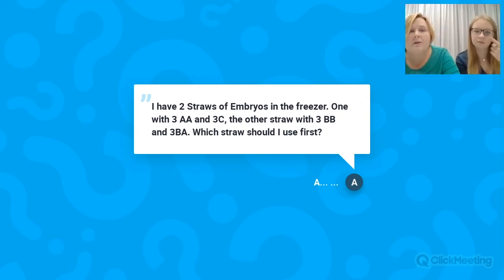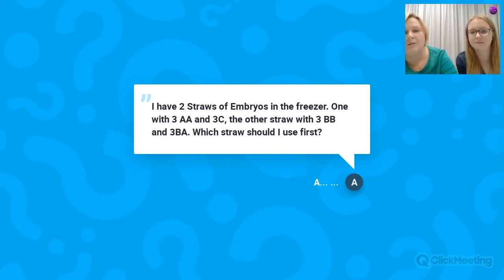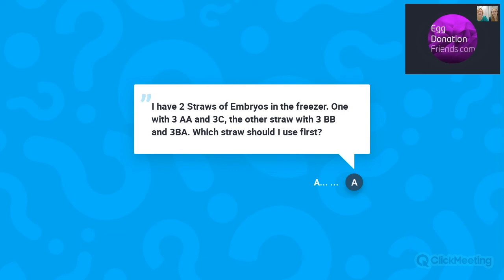First, 3A. Of course, it depends also on which days the embryos were frozen. If all the straws were frozen on day 5, first we use 3AA, next 3BA, third 3BB, and the last 3C. Sorry, because now I see that it is 2 straws only. First, we use the straw with 3BB and 3BA because they are good quality embryos, maybe not top, but good quality, and the 3C embryo is a poor embryo. So first we use 3BB and 3BA. Okay, thank you for this answer and for the question, of course, as well.